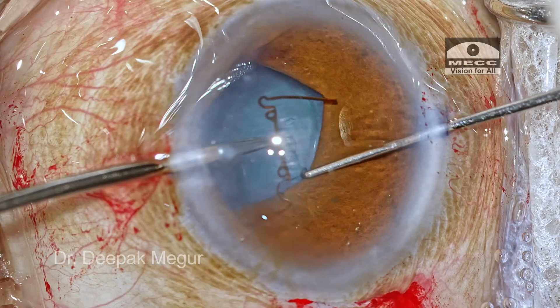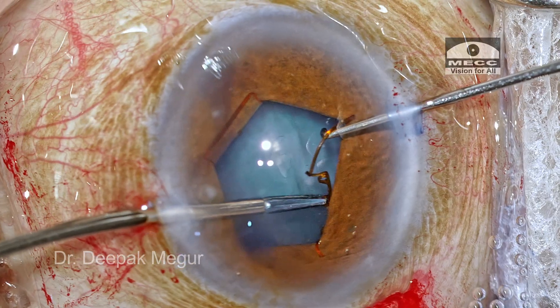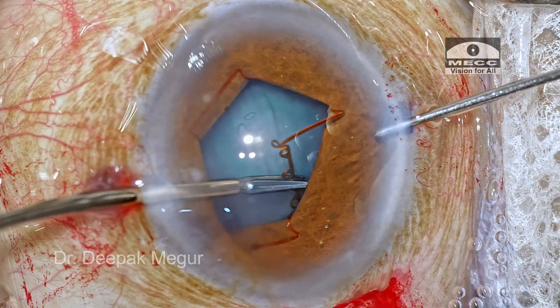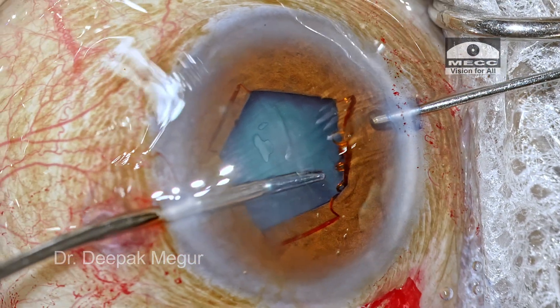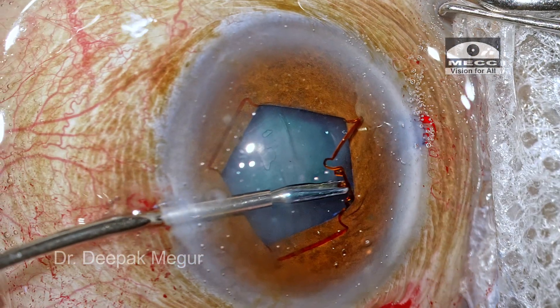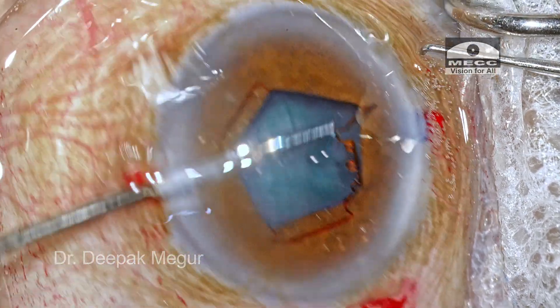I thought maybe retracting the pupil with the second instrument would help to engage. I was successful in engaging one notch, but the second remaining notch was not budging. In fact, the flange of the BX ring had turned vertical. After a couple more attempts, I realized this was a futile exercise.